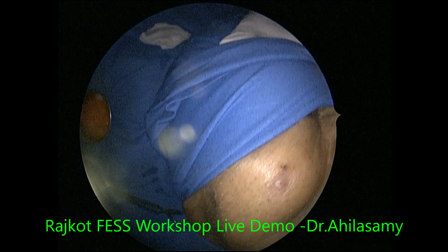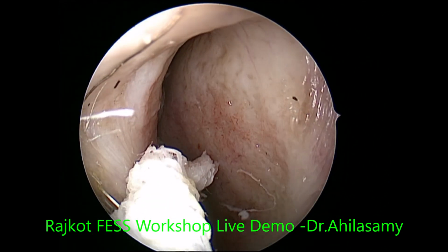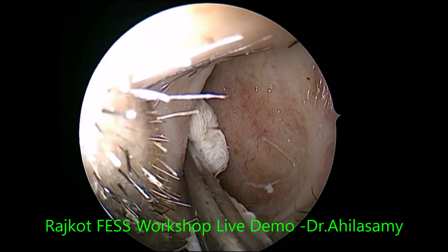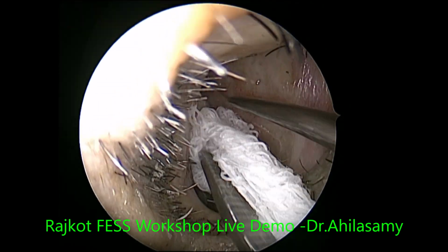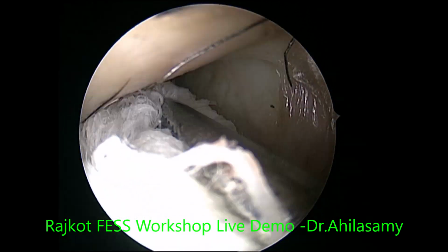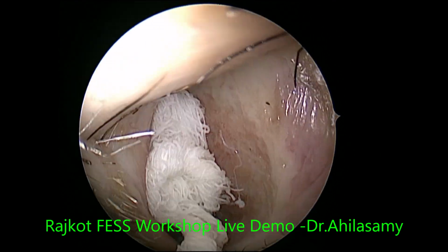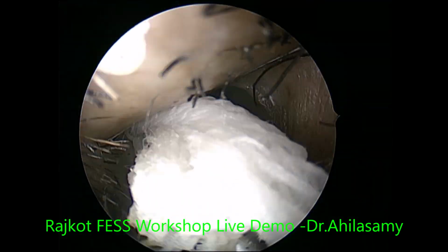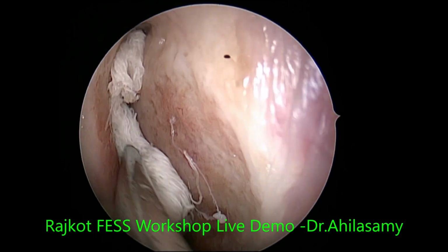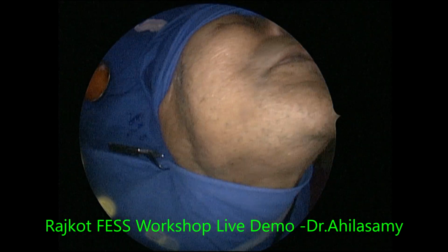One more pack. Today again I have gotten a very wonderful nursing team and a very cooperative, beautifully cooperating anesthetic team. Sorry, there are 4 ladies in the anesthesia team. No, all are beautiful and beautifully human. So I am in the middle of a luxurious cruising slowly. Okay. Now the external picture, please.